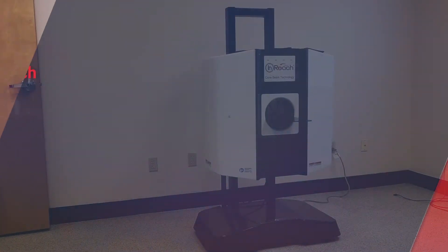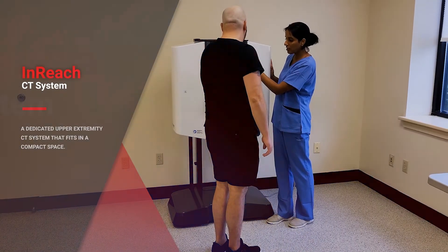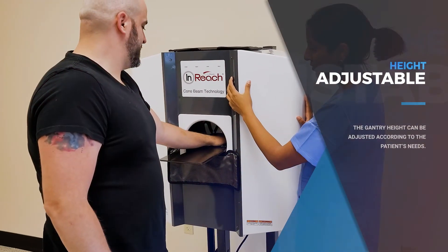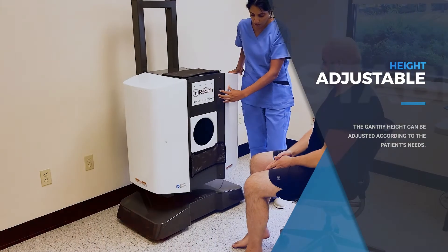The inReach is a dedicated upper extremity CT system that fits in a compact space. In this simple to operate device, the gantry height can be adjusted to the patient. Scan the hand and elbow in less than 25 seconds.